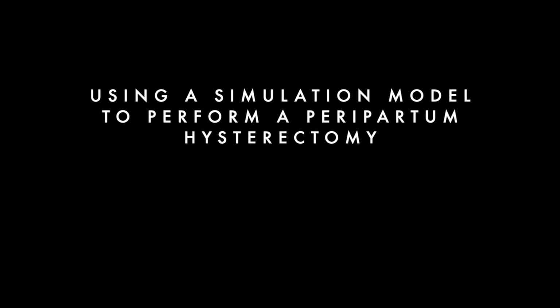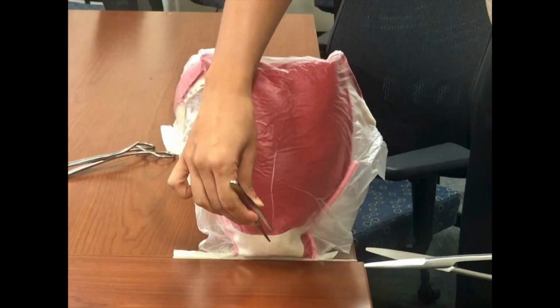In this part of the video, we will show you how to use the model to perform a peripartum hysterectomy. First, stabilize the model using a platform or secure it onto a surface with the model propped upright. Make sure you have all the necessary surgical tools before beginning.